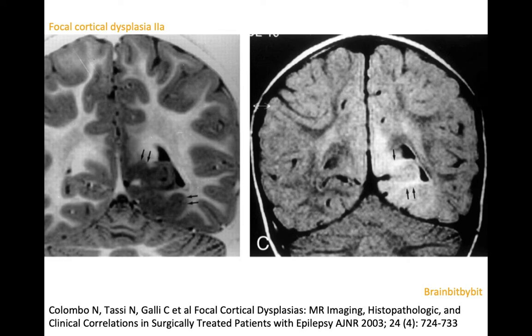The size of the FCD can vary from very small and subtle to very large, as you see on the FLAIR and coronal inversion recovery-weighted images of this patient in the left occipital lobe.